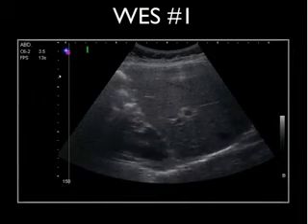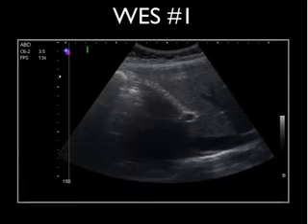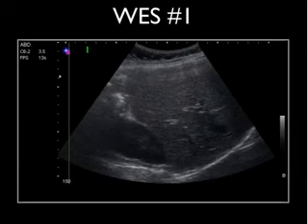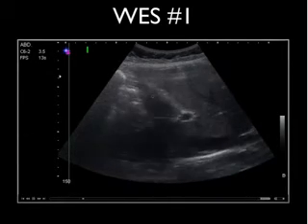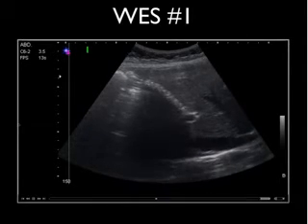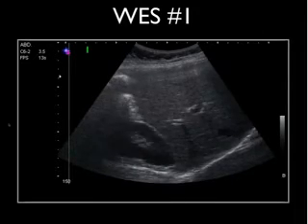So let's watch a video. Unfortunately, the sonographer has the probe turned around 180 degrees, but instead within the parenchyma of the liver we see a bright white line, and below that bright white line we see dark shadowing. This is wall echo shadow. You can also see this in the setting of a porcelain gallbladder.